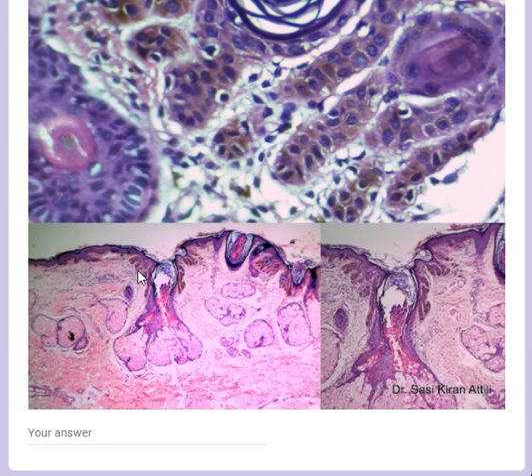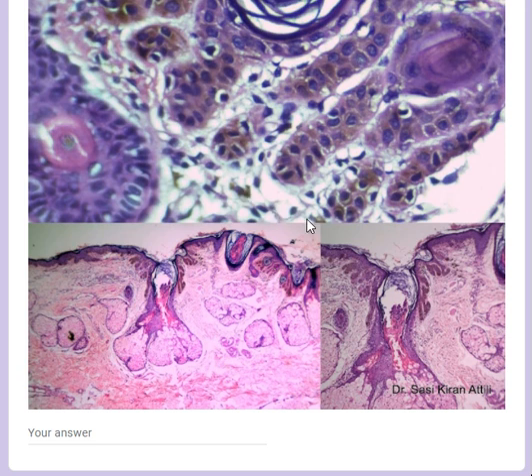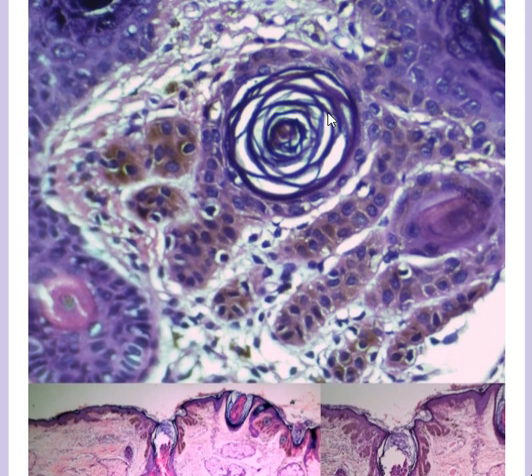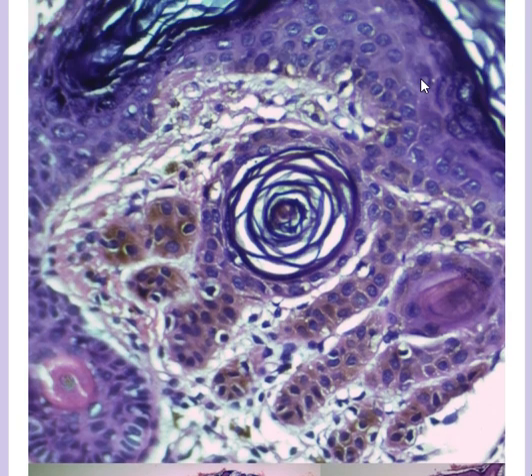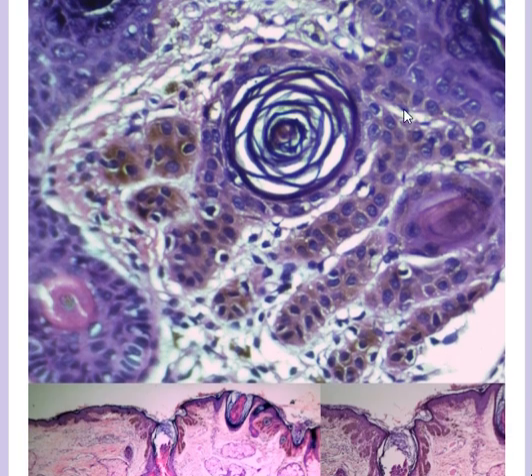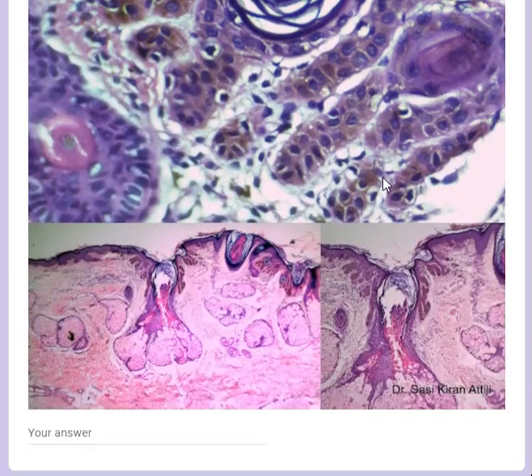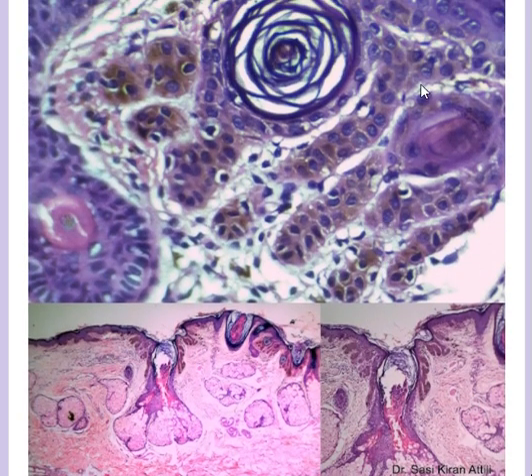You can see these sort of branching structures - what are described as antlers or like horns. On higher power, these structures are arising from the follicular infundibulum. These are higher power views of the same thing.